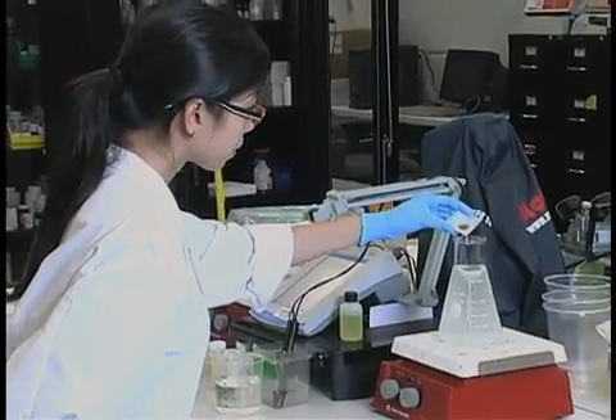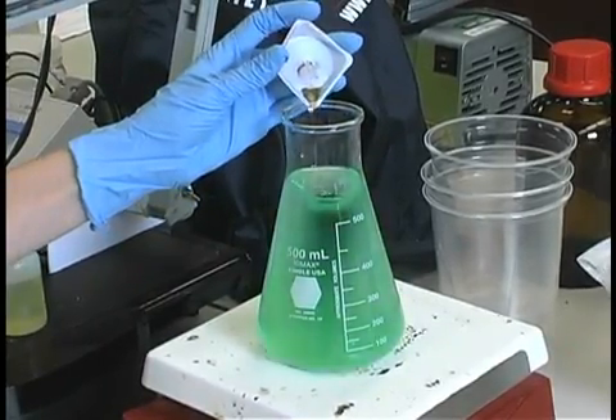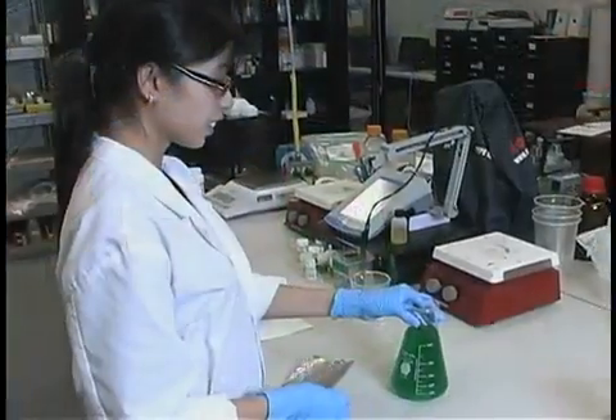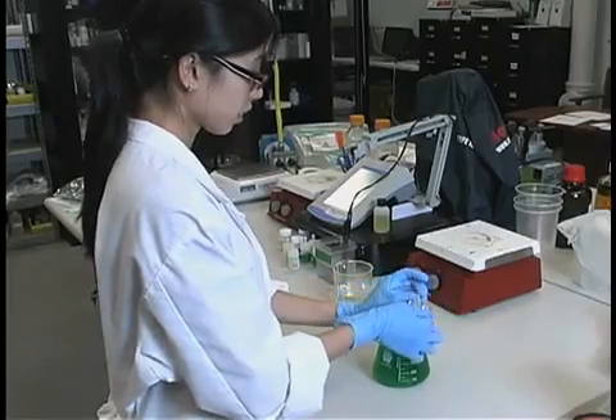You can also use powdered food color to color code your medium for easy identification. Red, green, blue, and yellow colors are sold individually or as a sample package under product M5856.